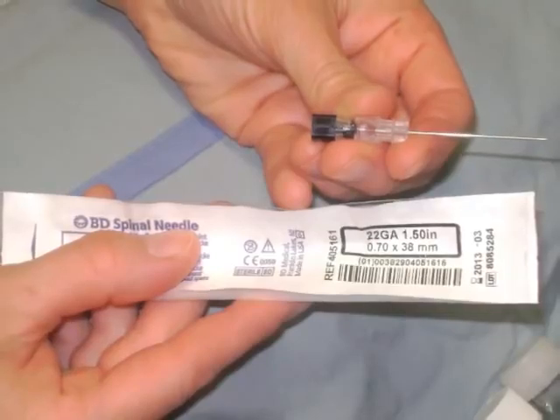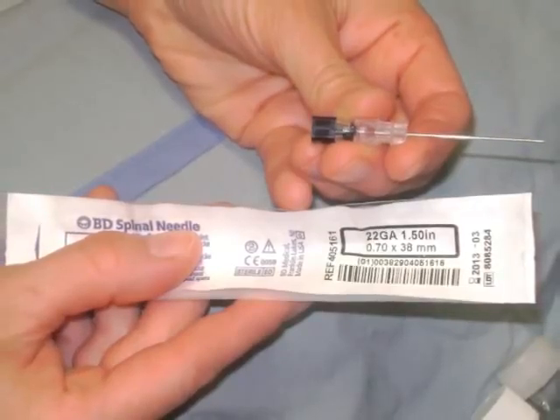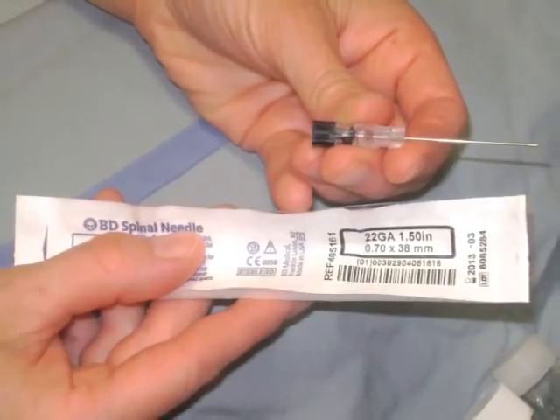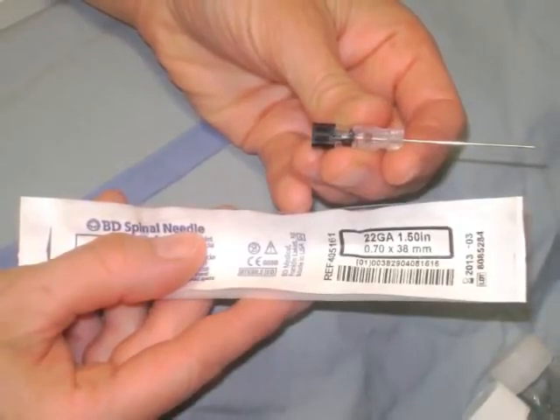For infants, you will typically use a 22 gauge 1.5 inch needle. Longer or larger gauge needles will be used for older children and adolescents.